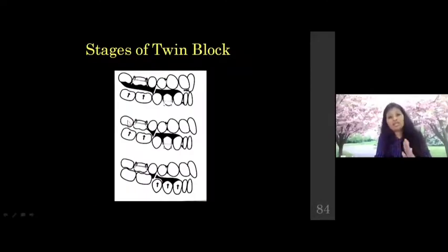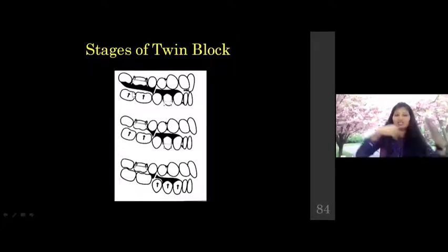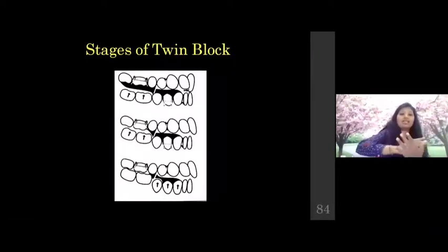After 1 month, when the pterygoid reflex is achieved, you're going to trim the upper block like this. You have to keep in mind that this particular surface has to be intact so that the inclined planes are touching each other. You're not going to touch the lower block for trimming, only the upper block you trim. And I told you posterior section should be wedge shaped. This is how the wedge shaping of posterior section will be. You trim 1 to 2 millimeter because you do not want to trim more than 2. If you trim more, you have open bite here. The tongue comes in, leading to what is called lateral tongue thrust, which you do not want.